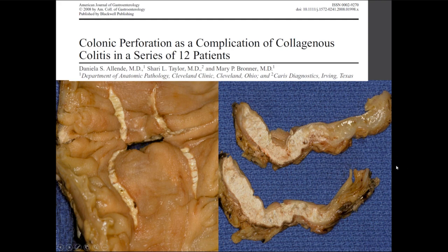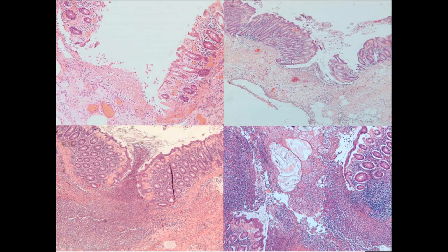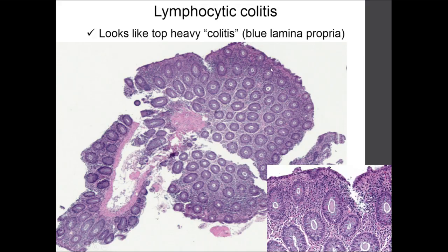So when we presented this series of cases with very well-defined features of collagenous colitis, now with these cracks, fissuring ulcers that were basically occurring after endoscopy, they felt a little more relieved that it wasn't their fault. Actually, the patient indeed had a predisposing condition for that.